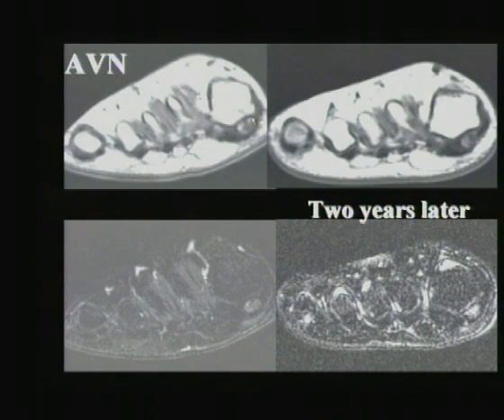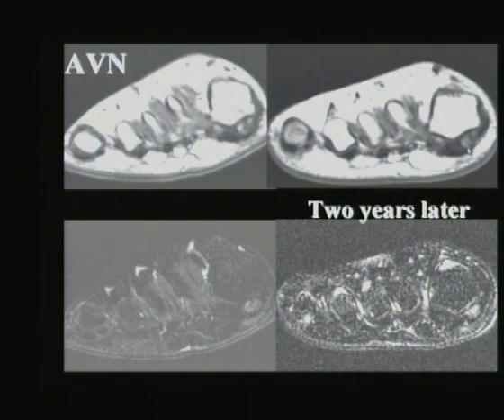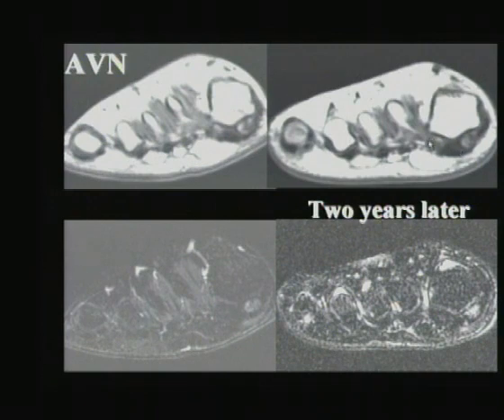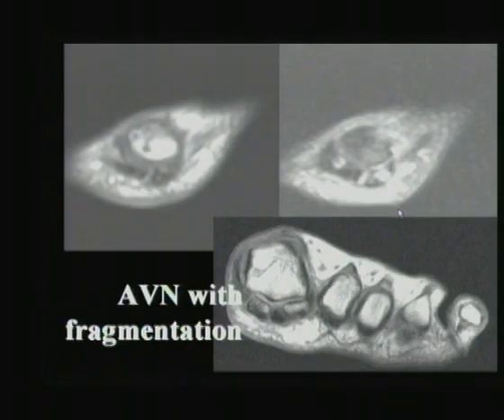This patient has relatively subtle edema on inversion recovery. On T1, only the medial-most portion of the sesamoid is abnormal. Two years later they have greater marrow edema on both T1 and inversion recovery, still with no kissing changes in the metatarsal head. If this were a fracture, it would have healed or gone to nonunion. It is not a bipartite sesamoid. So this is another example of avascular necrosis.